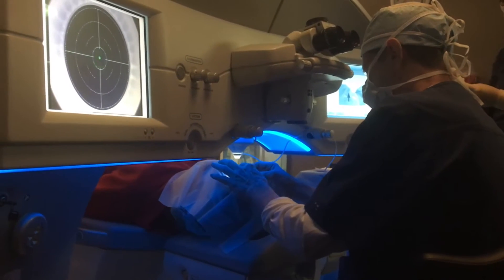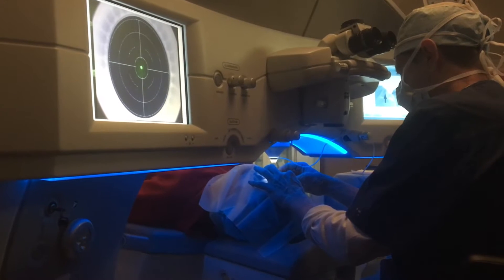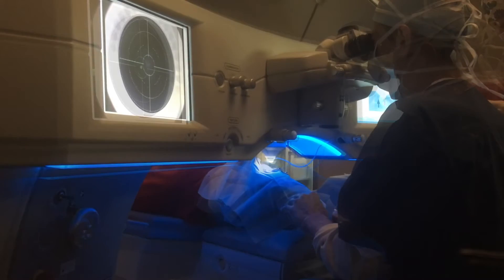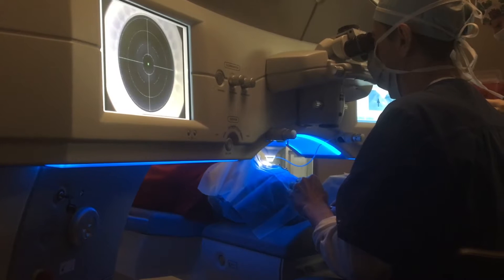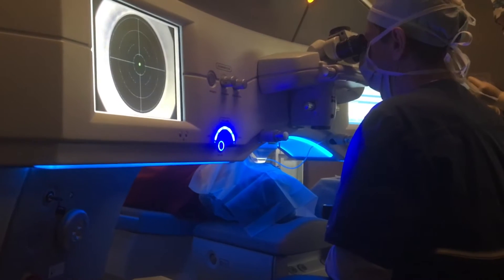I am now going to place an eyelid speculum that will hold the eye open while the procedure is being performed. The patient's bed will then be raised, as you can see here, until there is contact with the contact glass, and you can see this in the monitor as well.